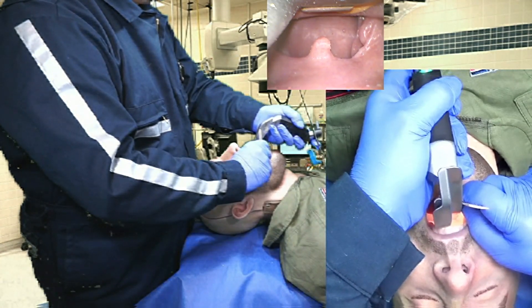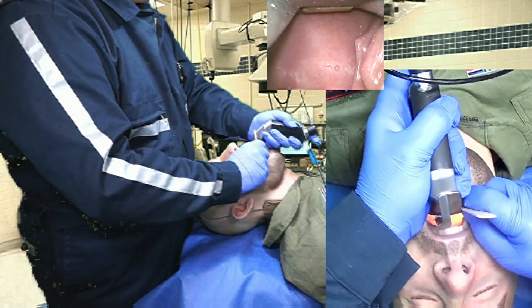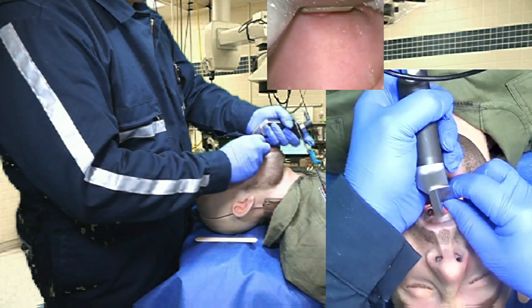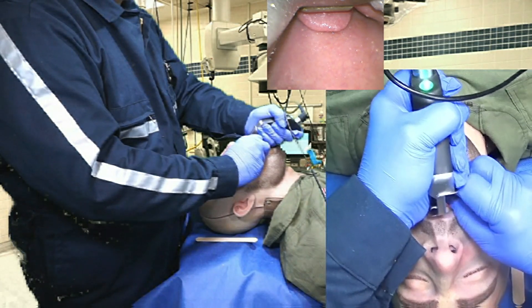I'm going to put the CMAX size 4 over the tongue depressor itself. I've just passed that tongue depressor — I'm going to take the tongue depressor out and put it down. Now I'm going to go into my salad pinch mode and bring the tip of the CMAX around the base of the tongue.